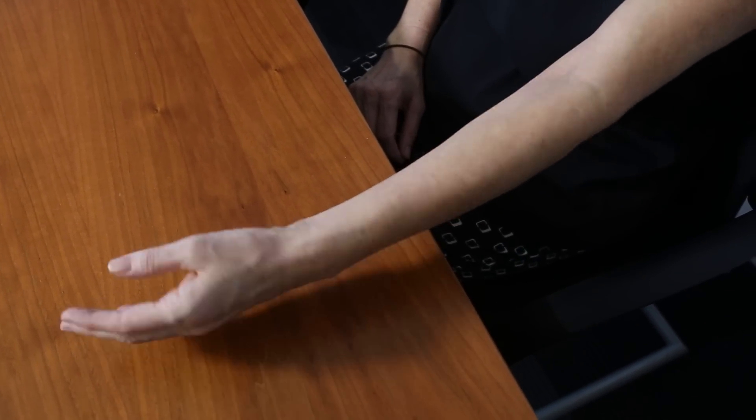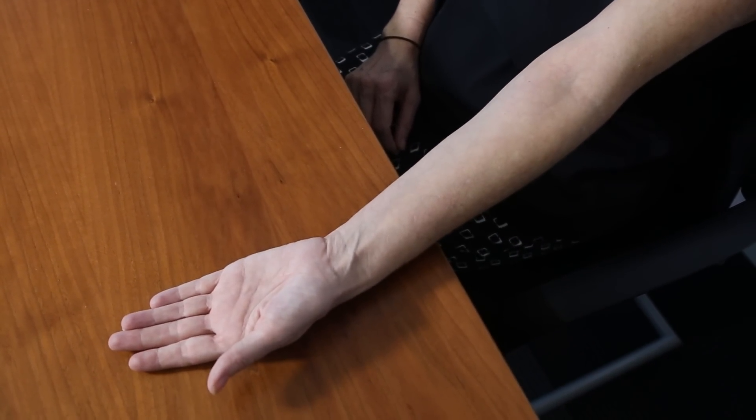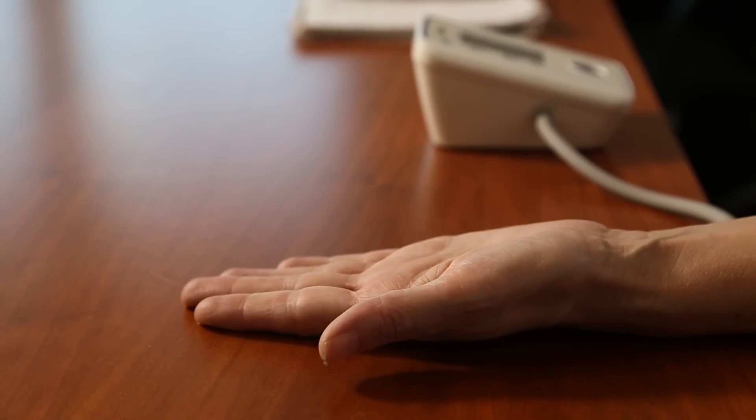Rest your arm on the table so your forearm is about level with your heart. Stretch your arm out with the palm facing upwards.